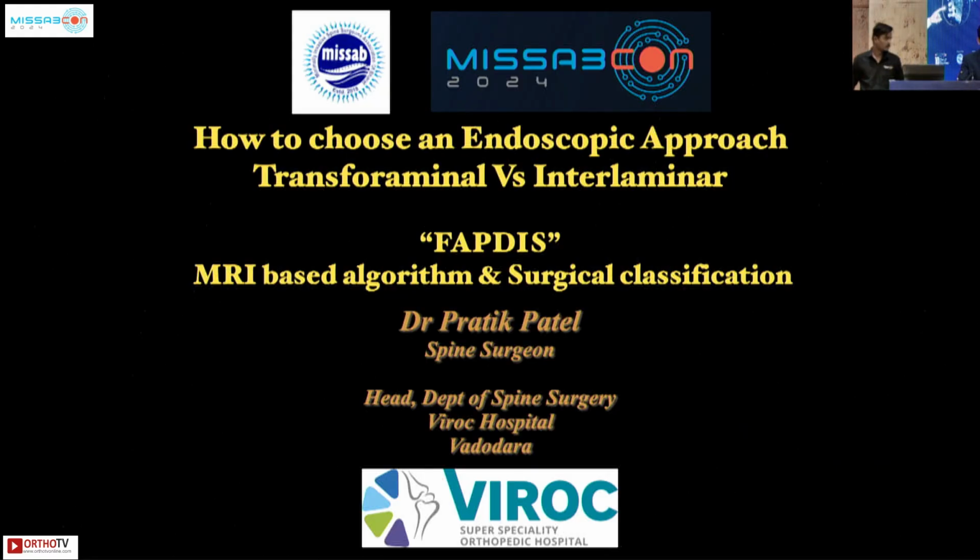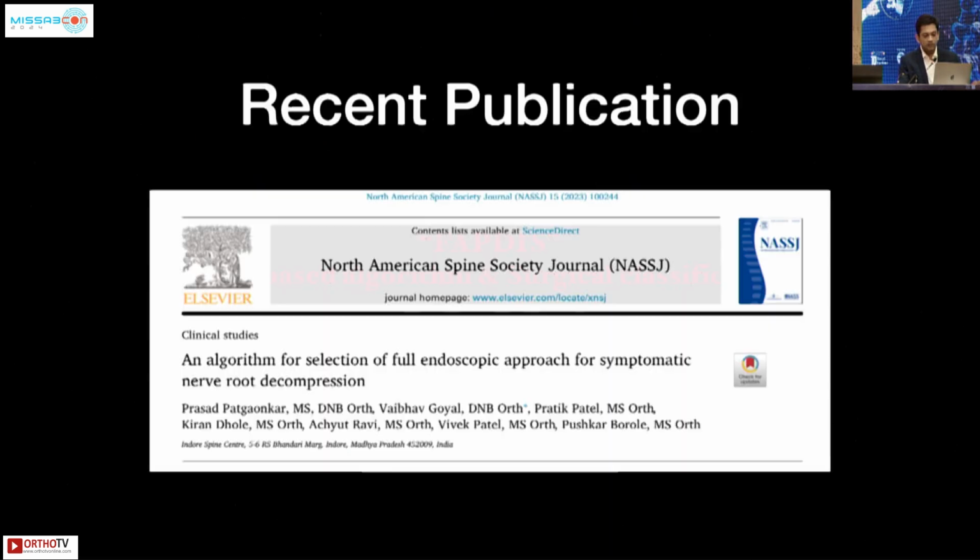Today my presentation is on the FAPDIS algorithm, which is an MRI-based algorithm and surgical classification. This approach mainly helps us decide whether we should go transforaminal or interlaminar endoscopy. This publication is already published in the North American Spine Society. When I was with Dr. Prasad Padgaonkar, we made this FAPDIS algorithm.